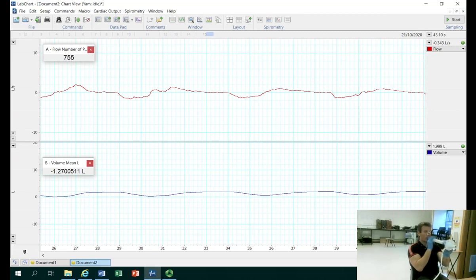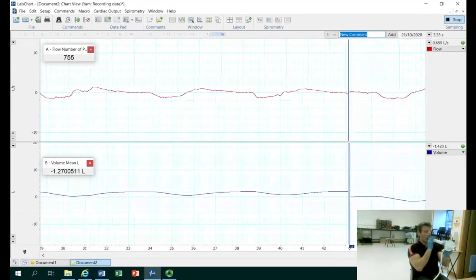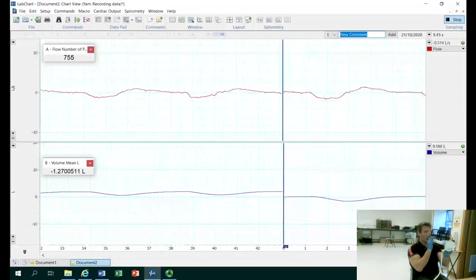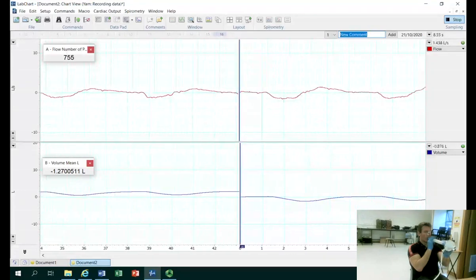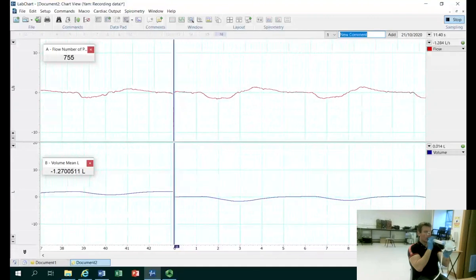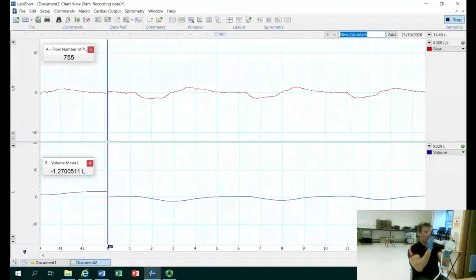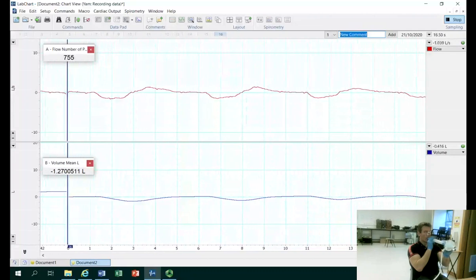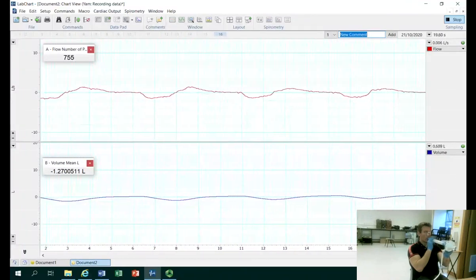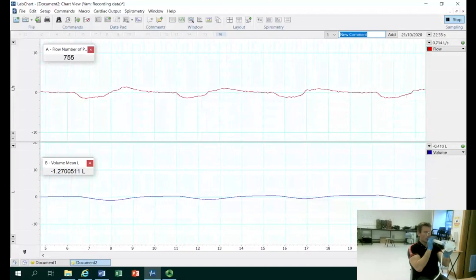At the end of that minute — which I'll start now — we will look to ask the participant to do an inspiration from the top of their normal tidal volume, to take as much air in as they can, and then to breathe out forcefully until they've exhaled all air from their lungs.